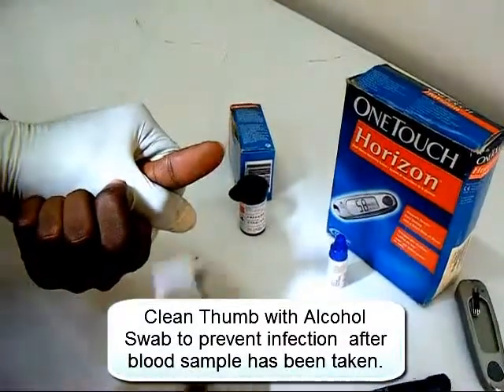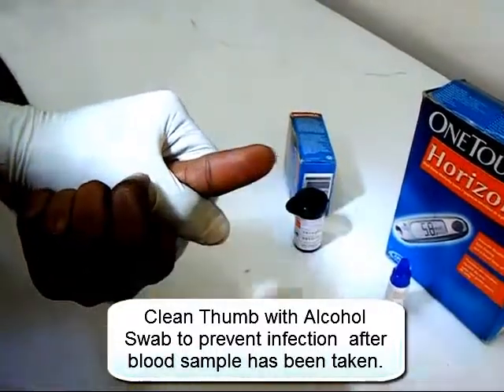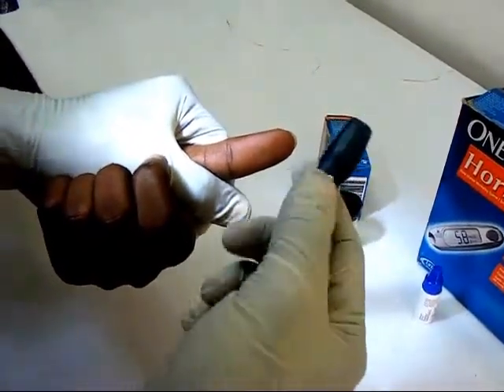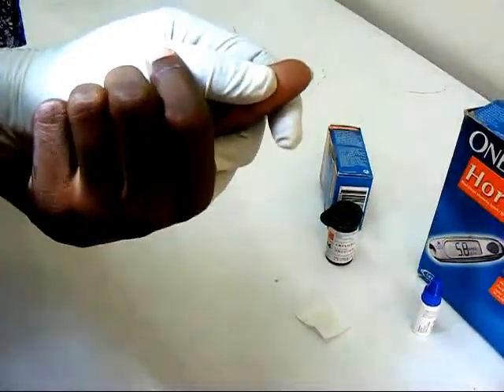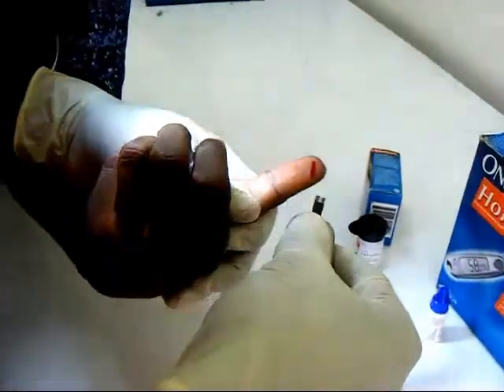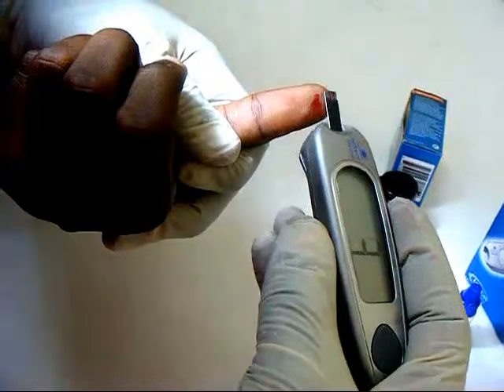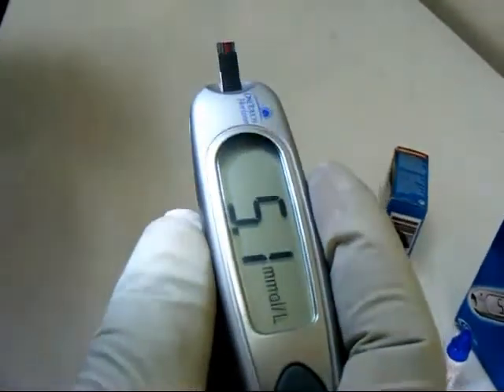The lancet holder is now ready for use. The lancet is used to prick the tip of the thumb and the blood is collected with the test strip. The blood glucose concentration is then displayed on the meter after a few seconds.